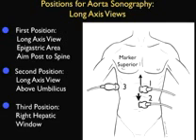Now, if we're struggling to see the aorta from the anterior planes as shown here in probe positions 1 and 2, we can always look from the right hepatic window as shown in probe position 3. Place the probe over at about the level of the right upper quadrant trauma FAST exam with the probe marker towards the patient's head. One can then image the aorta by angling the probe anterior to the kidney to see the IVC and aorta in long axis configuration.